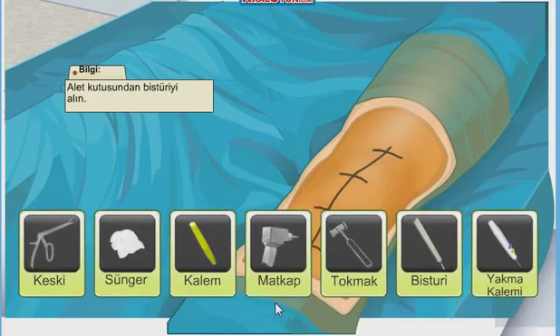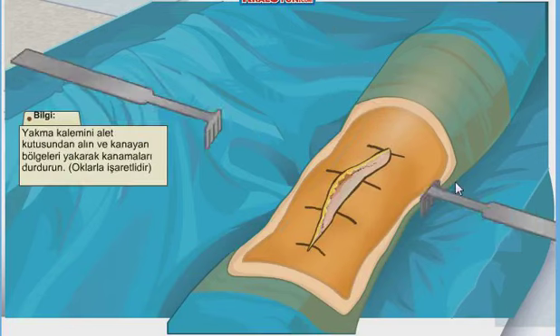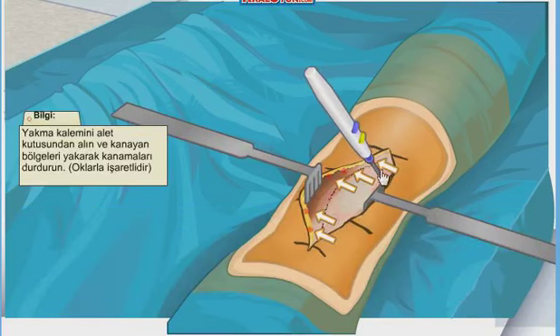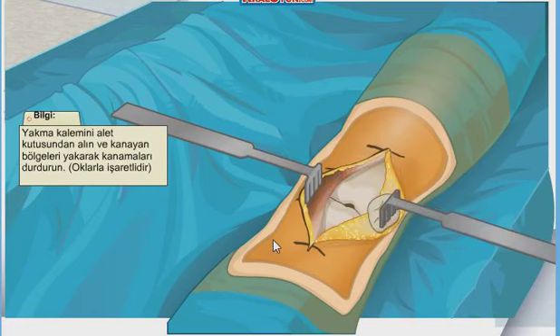Take the scalpel and cut the skin following your marking. Let's use the Bovie pencil to cauterize the veins. This will help decrease blood flow into the surgical field. The rake retractors fold the skin and tissue out of the way, exposing our patient's knee.